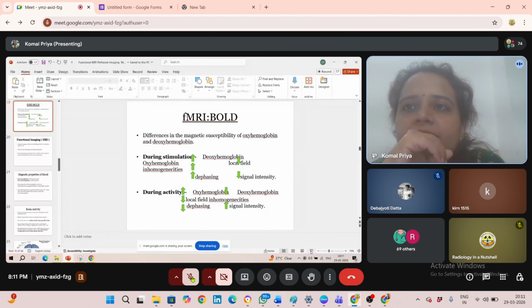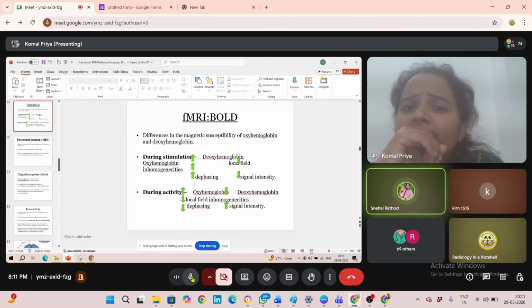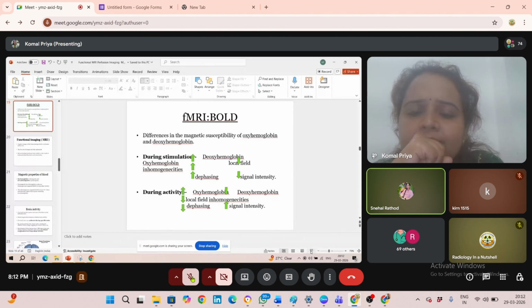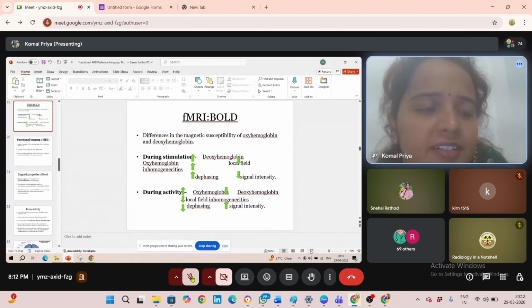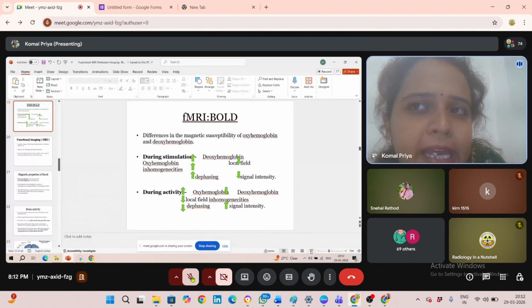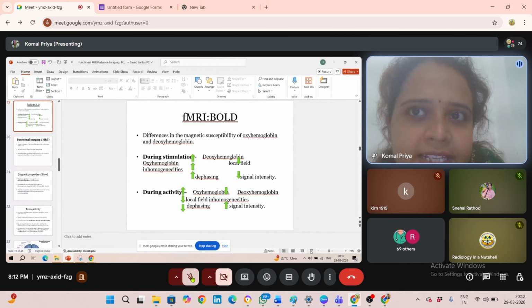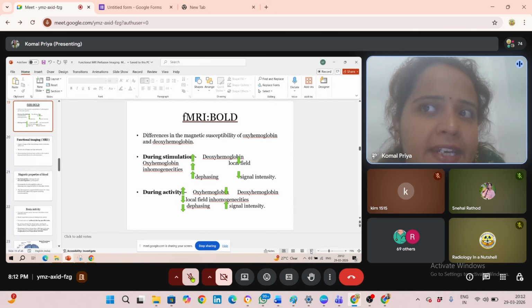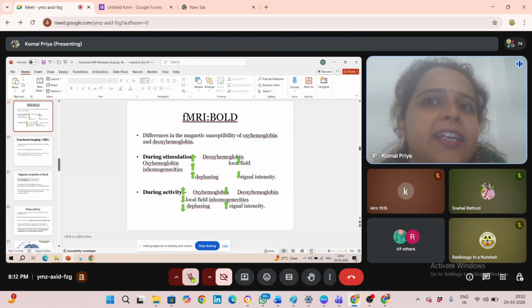Attracted. Paramagnetic are attracted and diamagnetic are repelled. Okay, so paramagnetic is your deoxyhemoglobin and diamagnetic is your oxyhemoglobin.